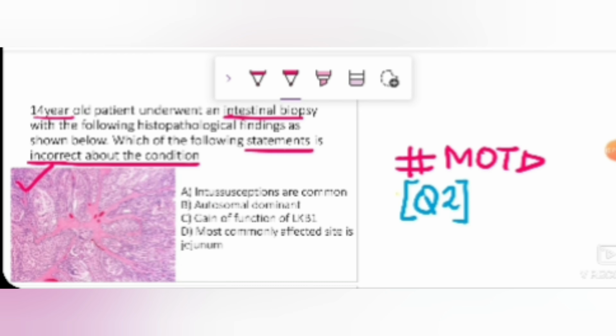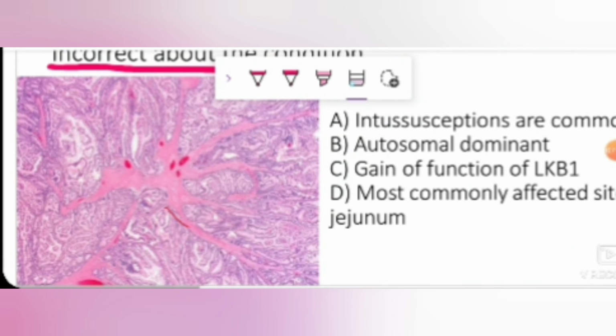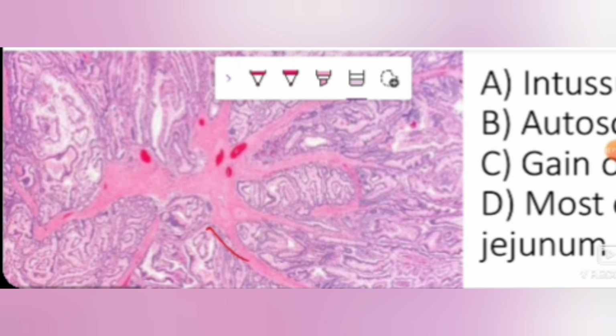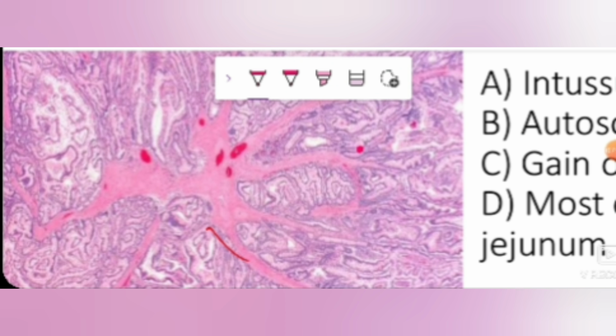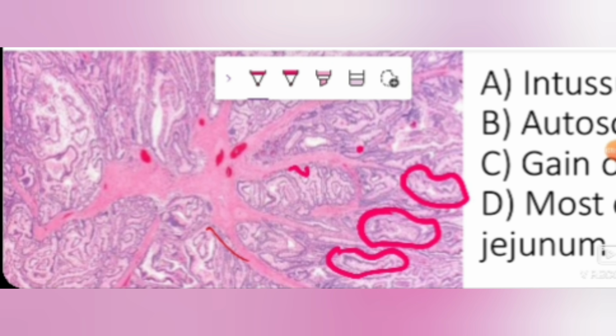Let's read about it. So first and foremost, the catch point over here was this image. If I zoom into this image, what do you notice? I'll zoom in as much as I can. Can you appreciate? See, it's an intestinal biopsy, so it's been taken from the intestine. Can you all appreciate some round glands? Yes, the epithelial round glands. And who is coming in between these glands?